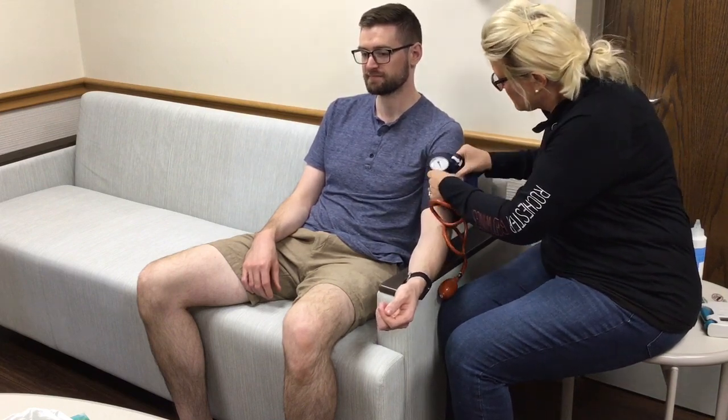Next, place the blood pressure cuff around the arm a few inches above where you are looking to obtain a pulse. Be sure the knob on the blood pressure cuff is turned all the way to the right but not too tight. Place a dollop of conduction gel on the desired location — it can be in the inside bend of the elbow or the wrist.